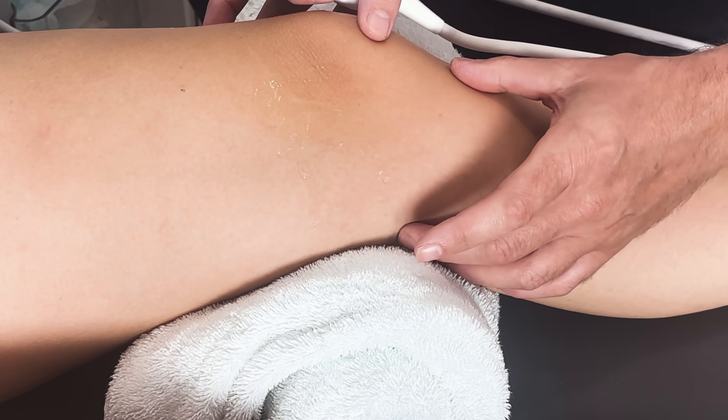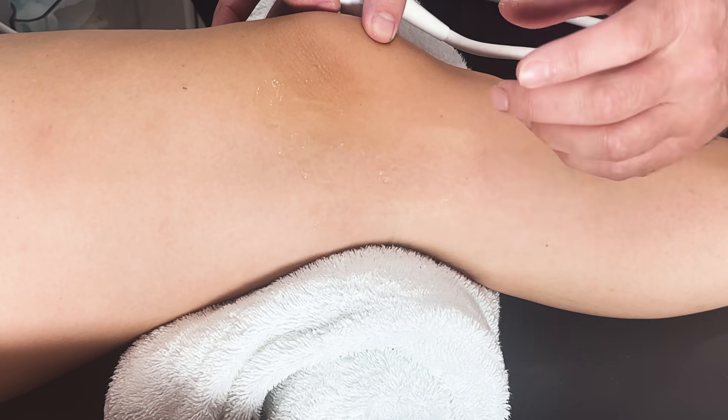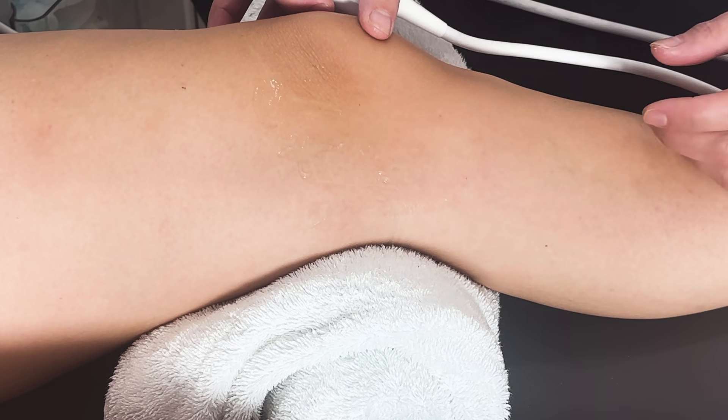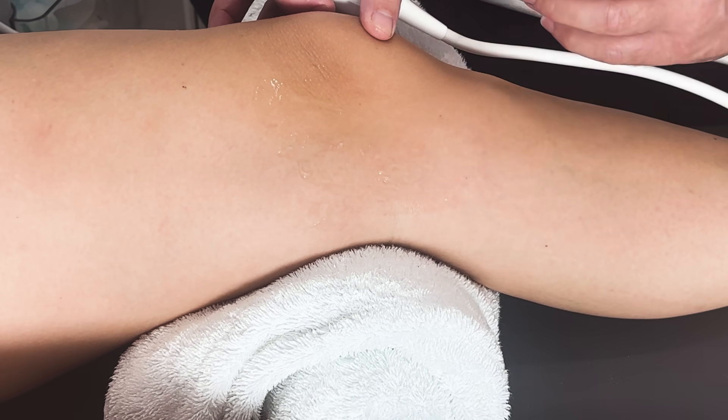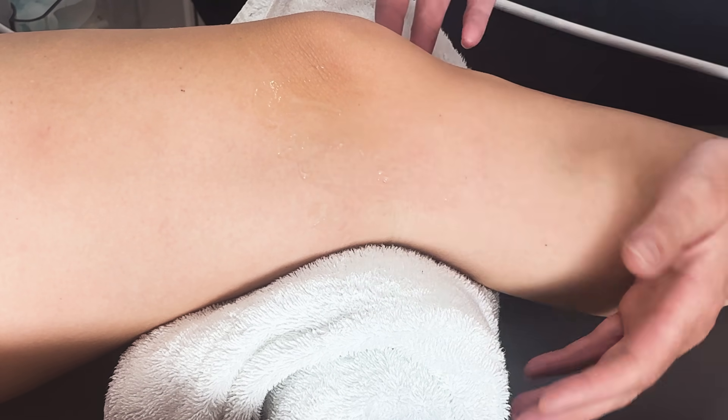I'm going to do a video to look at the medial collateral ligament, which comes down the medial side. I'm doing this video because quite a few of the people I'm supervising at the moment are really struggling to get a nice clear image of the MCL.